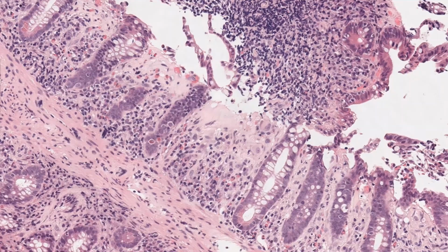That's absolutely fine. Yes. So what I am trying to tell you now, that in the first glance, it was difficult to highlight that this is collagenous colitis because we didn't see those proper areas. It wasn't widely distributed. And collagenous colitis is focal and it is patchy, right? So if you are lucky, you might get it. If you are unlucky, you might not get it, right? So that is why you cannot rule it out.